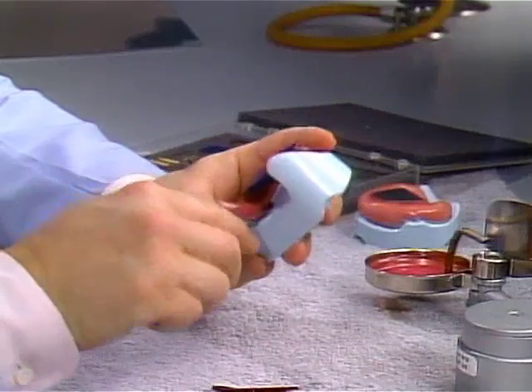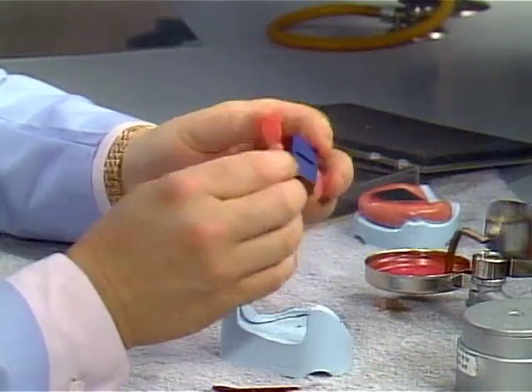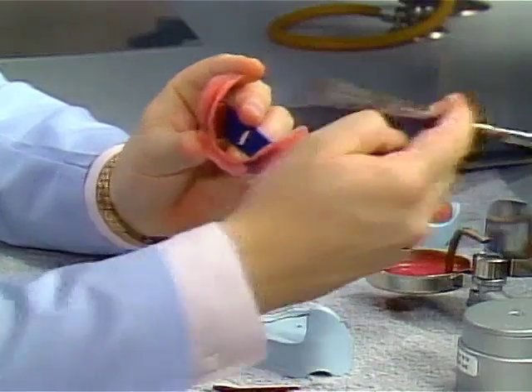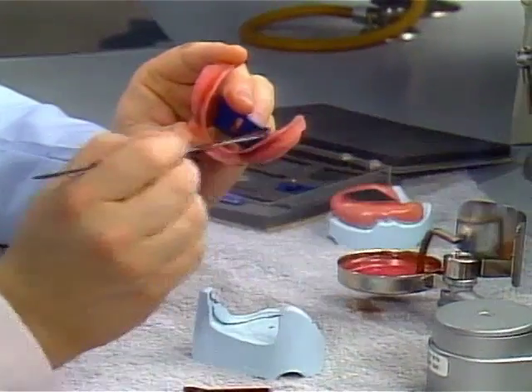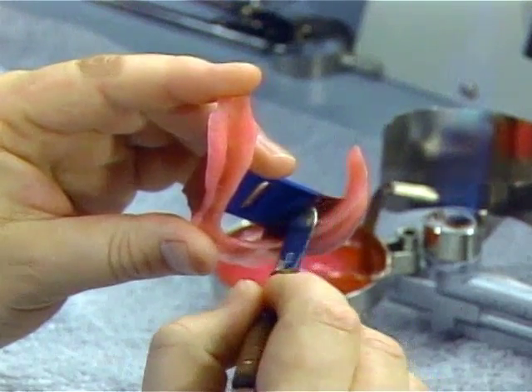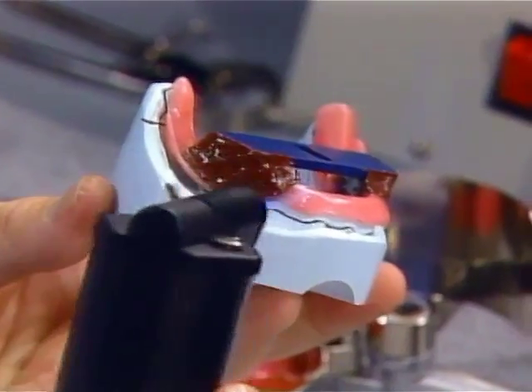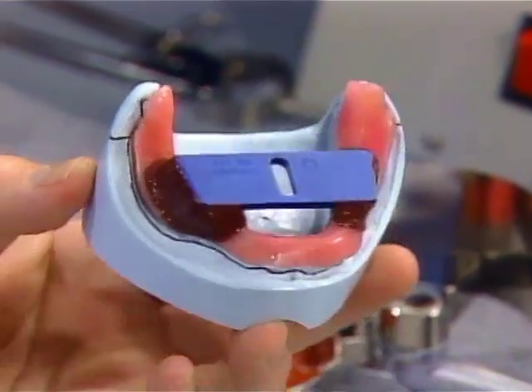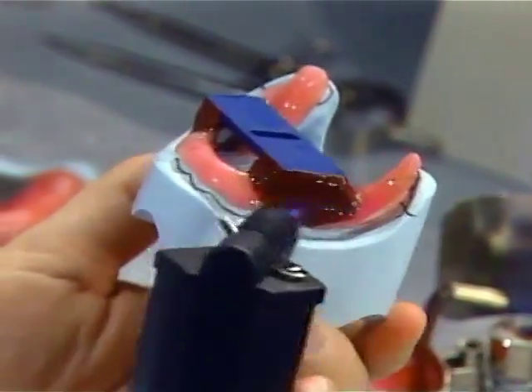Remove the base from the cast. Trim away excess compound and seal the bar on the lingual. Make sure there is enough room between the bar and the cast for the rest of the assembly: sleeve, hex nut, and pin. Grind the cast if necessary. Clean excess compound off the top surface of the bar. Flame the compound lightly to produce a smooth surface.